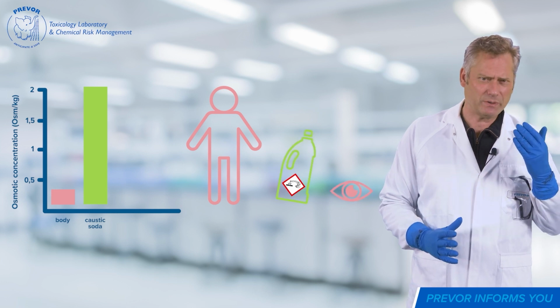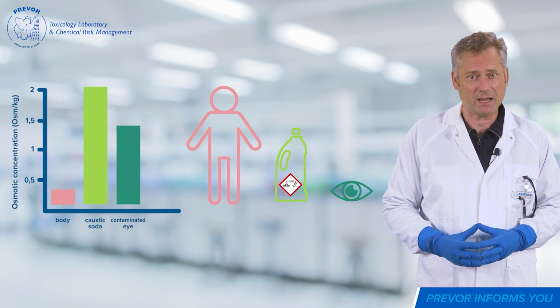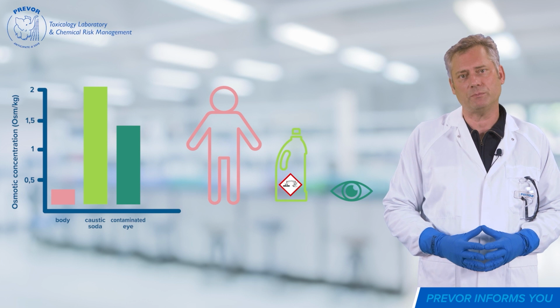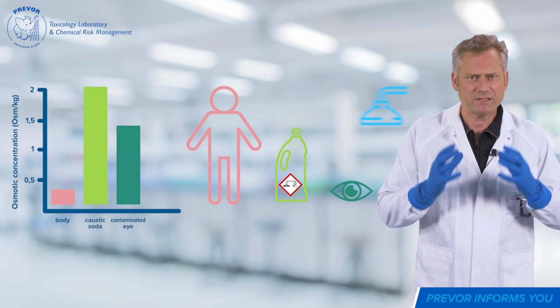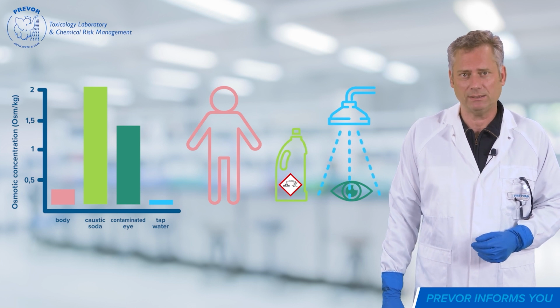Unfortunately, I get splashed with this chemical in my eye. The concentration of ions in the contaminated eye increases, so the osmolarity rises to about 1.4 osmoles per kilogram. I start to rinse as quickly as possible and use the safety shower with tap water.